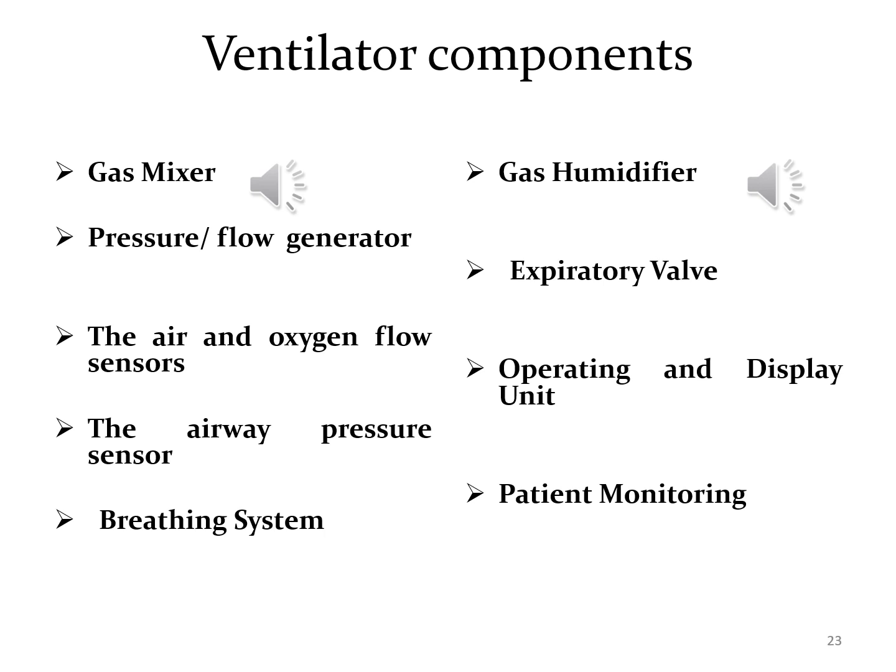Operating and display unit: touch screens designed to display pressure and flow curves, as well as multiple menus for setting different ventilation modes, adjusting alarm limits, or measured value overviews.